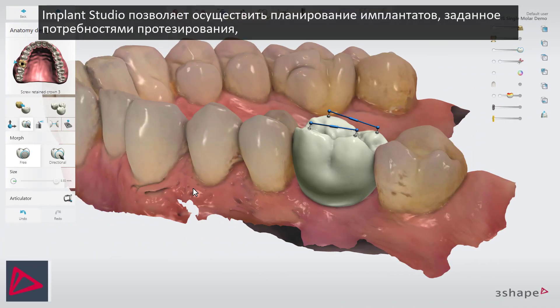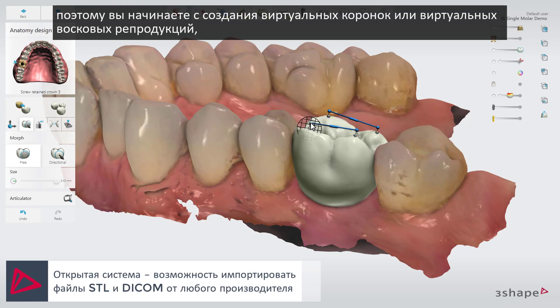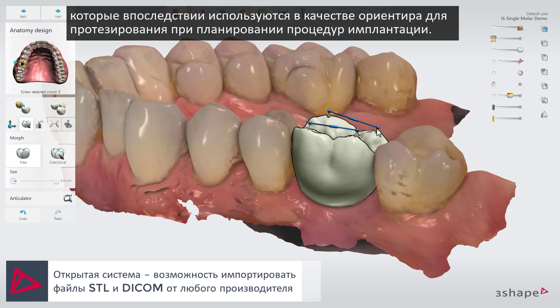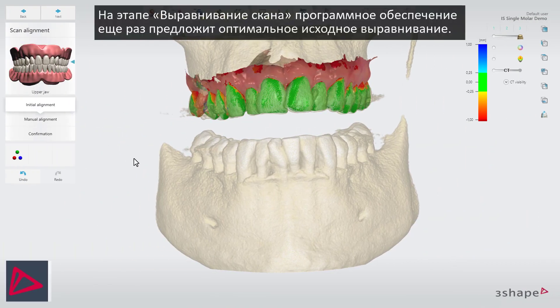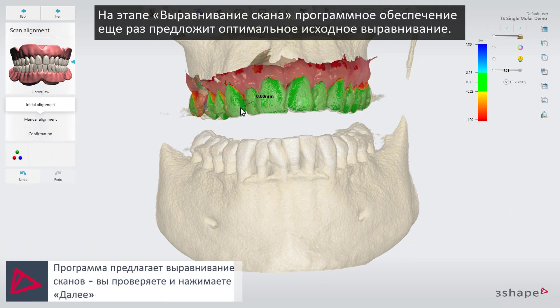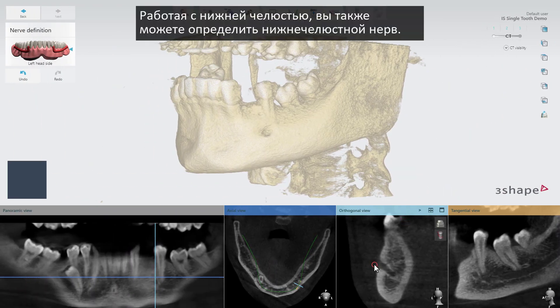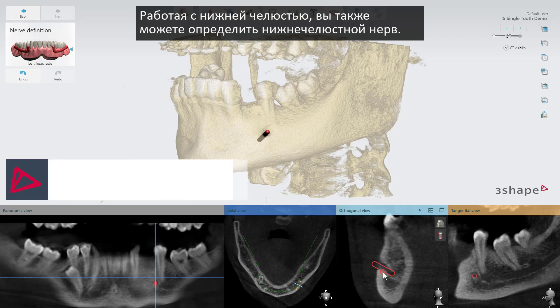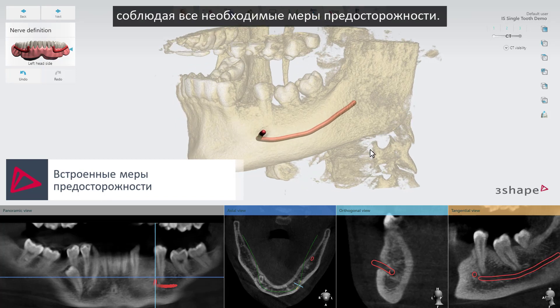Implant Studio enables prosthetic-driven implant planning. So you start by designing virtual crowns or virtual wax-ups, which are later used as your prosthetic reference when you plan the implant treatment. In the scan alignment step, the software will propose an initial optimal alignment. When working on the lower jaw, you can also define the mandibular nerve. A clearly defined nerve helps you realize the best possible way to plan your treatments while taking the necessary precautions.